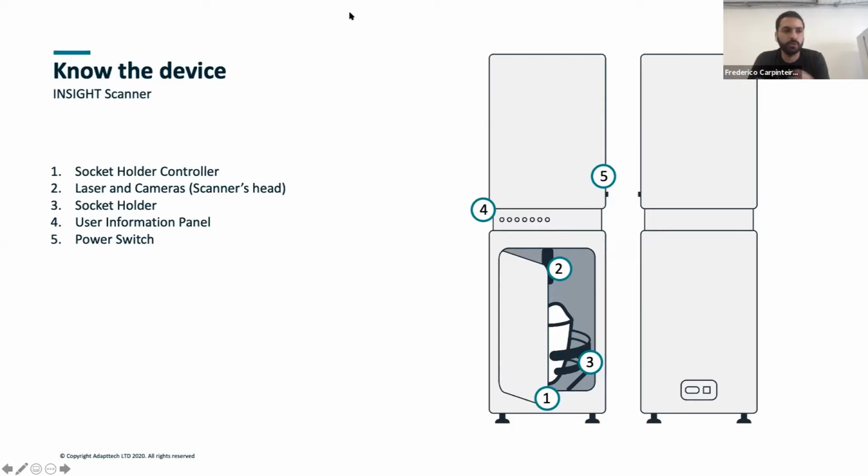As Phil said, I'm going to talk about each of the individual parts, and as much as possible, I'll try to demonstrate it on the actual device to make it easier to understand.